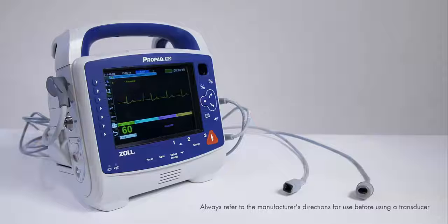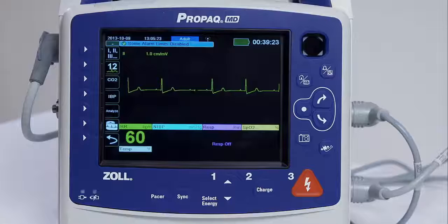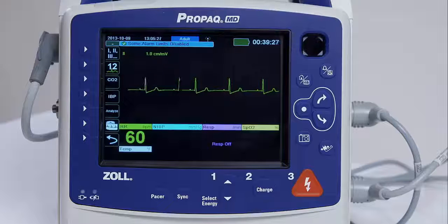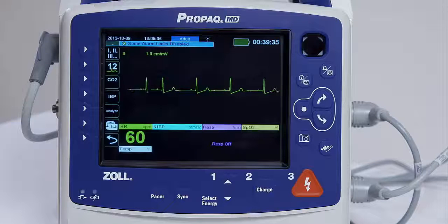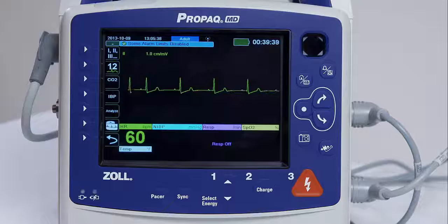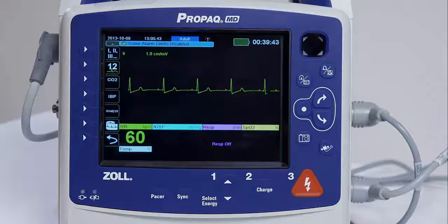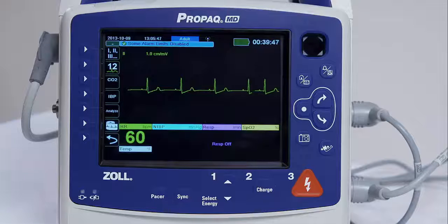Each channel requires its own connector, cabling, and pressure transducer. The ProPakMD unit is compatible with many types of invasive pressure transducers, including non-disposable and fully disposable transducers. The transducer cable must have a 6-pin AAMI cable connector so that it can plug into a ProPakMD pressure channel. Always refer to the manufacturer's directions before using a transducer.